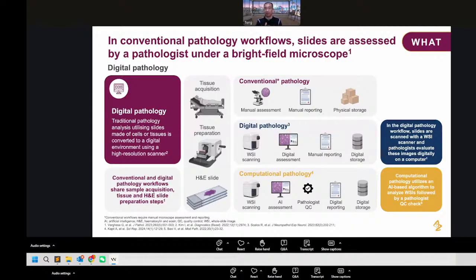And then computational pathology is on top of digital pathology, because AI-driven assessment needs the slides to be digitized first. That is a prerequisite for computational pathology. So based on digital pathology, the AI will use algorithms to try to give the score of the different biomarkers, instead of a pathologist manually saying this is the positivity, how much, even when checking the digital pathology on the monitor.